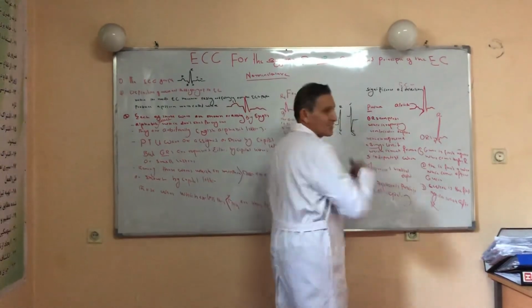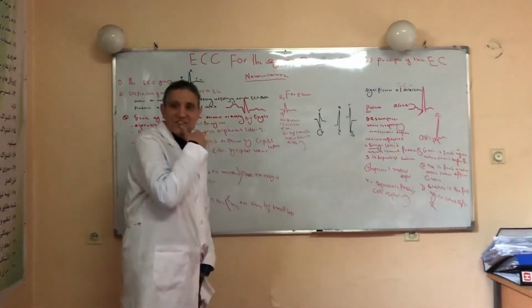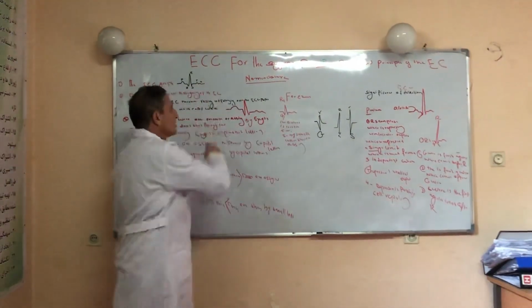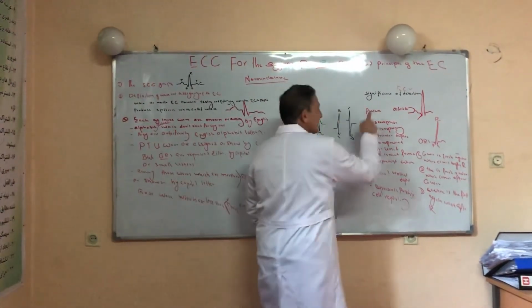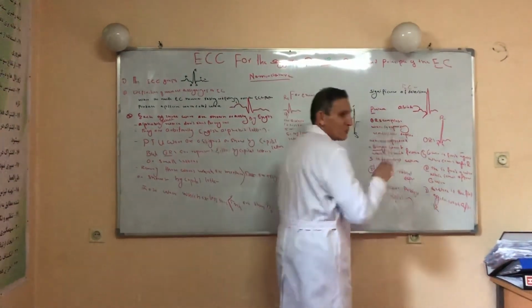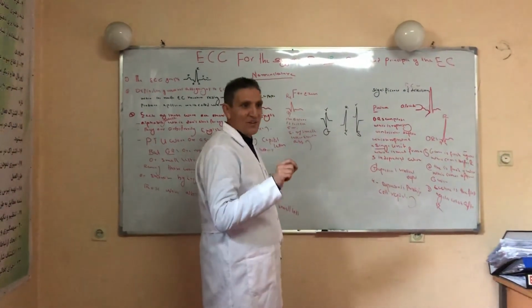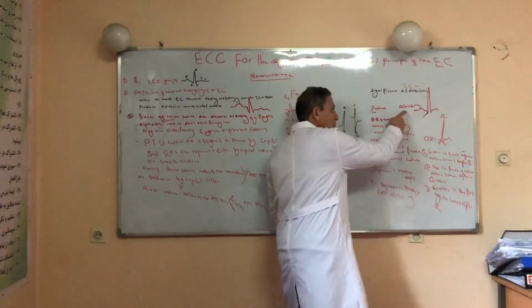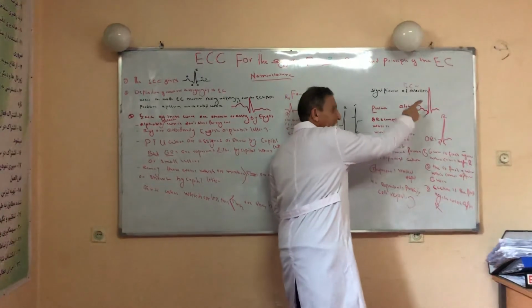Another topic: significance of ECG deflection. What does it mean? Right now, again, we come to this ECG graph, and what does the P wave represent? What kind of wave is it? This is a small, round-shaped wave, and it is the first positive wave, which comes earlier than the others.